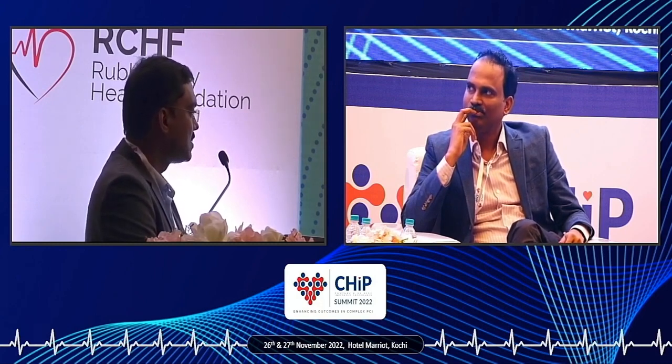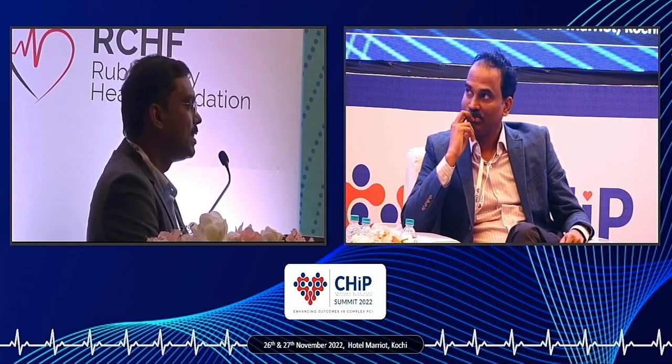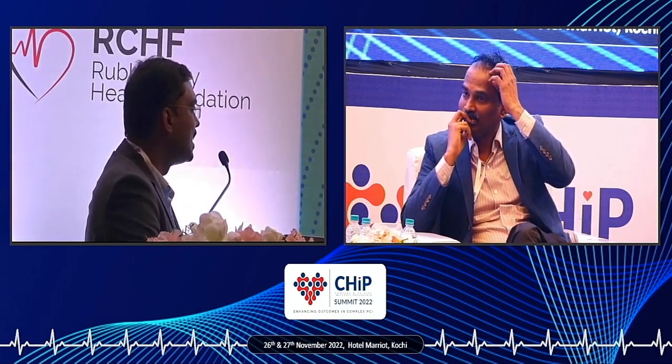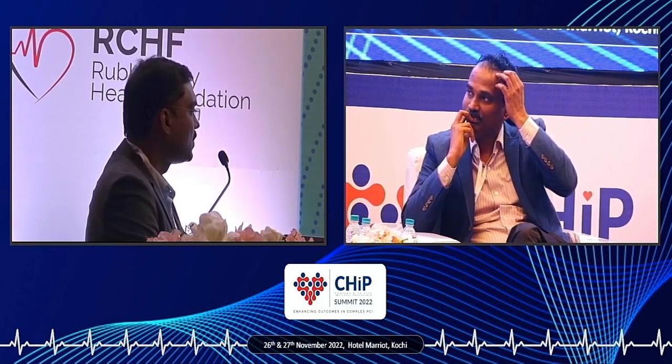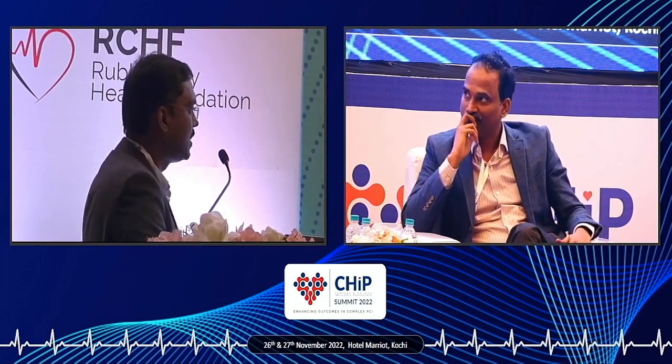I don't have much data except for a small trial from China which has shown that DCB in the LCX ostium the first time itself can give some good results. But that's what I will be doing. As you rightly said, not only for left main restenosis, for any kind of restenosis, this is an adjunctive tool. The only mechanism they are describing is that it ablates all the restenotic tissue. So we will get a good plaque volume reduction, but in the long term we don't know. Long-term data is not much available, especially for diffuse ISR.